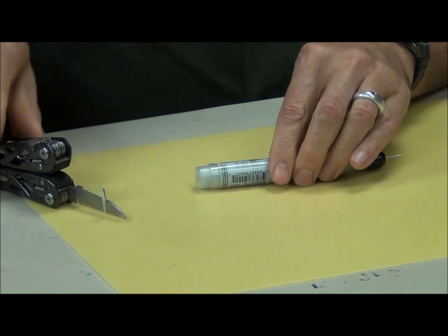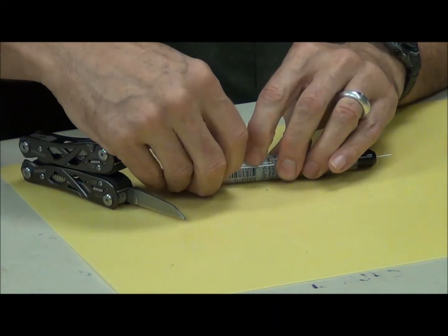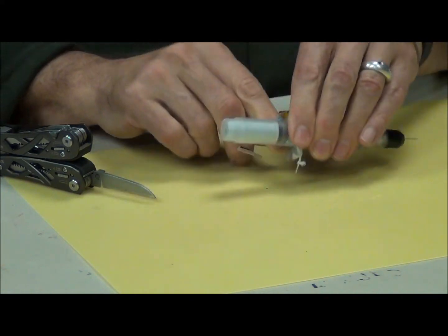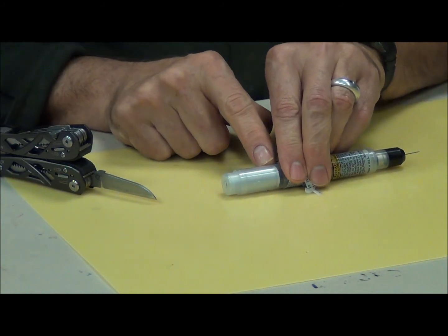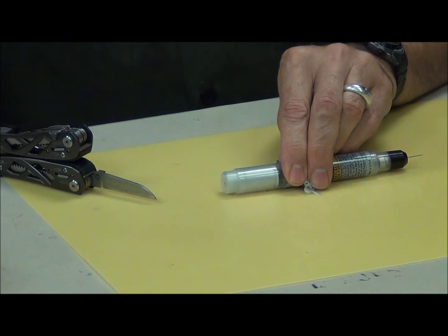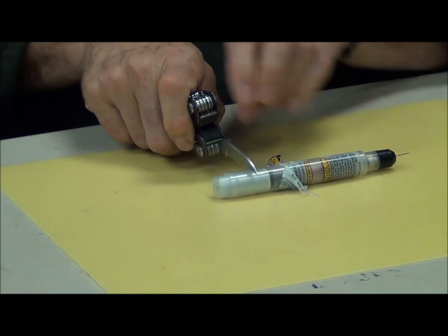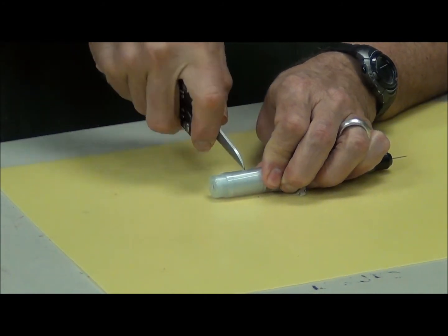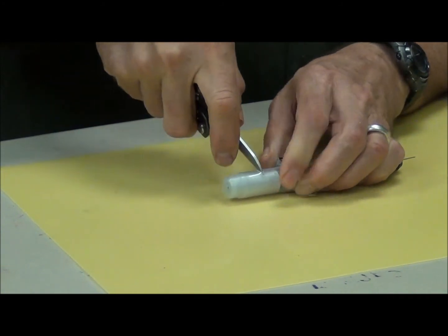you'll see that there's a white plastic cap at the end. And this white plastic cap right here is the case for the spring. When we remove the plastic from the cap, it's going to shoot with a great deal of force. So we have something downstream to catch it. We're just now going to cut through this, be careful with the needle. We're just going to cut through this plastic. And it's easier to do with a thinner knife blade, but this is what I happen to have.